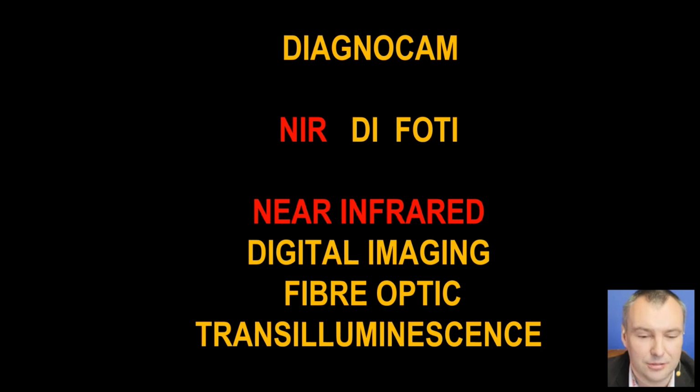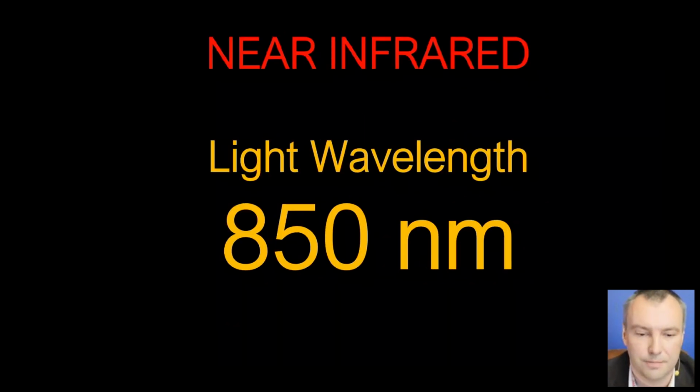DiagnoCam is a device that, for the method of work, we can explain as NEAR-DI-FOTI. Near is for near infrared, which is the wavelength that the device is working on during transillumination. DI is for digital imaging, which is quite obvious, and FOTI is for fiber optic transillumination. Again, I think this is the method. For really tough patients, believe me, you will meet some.